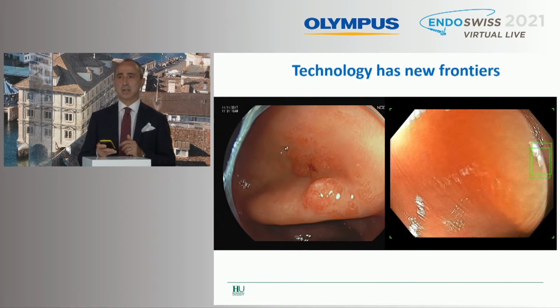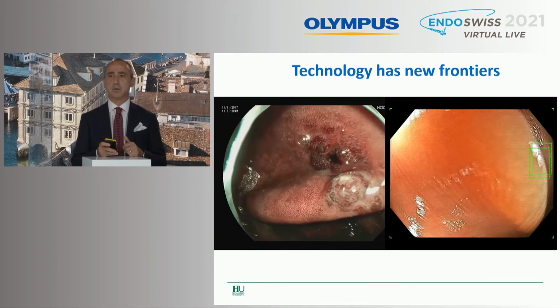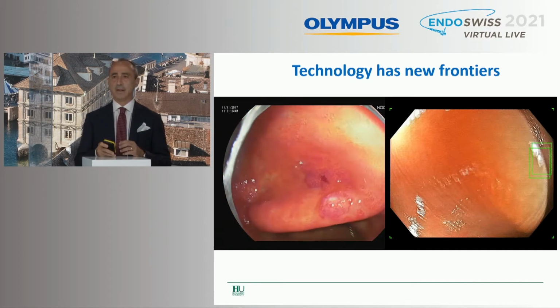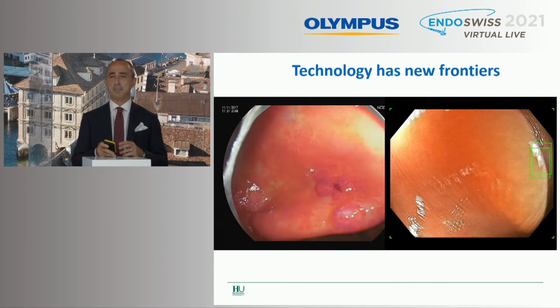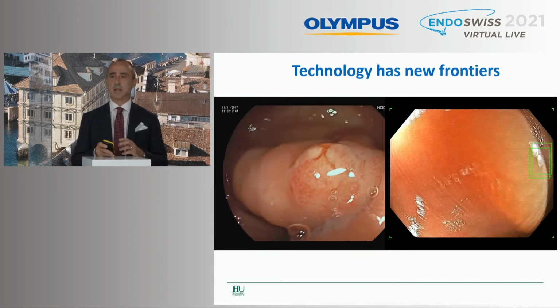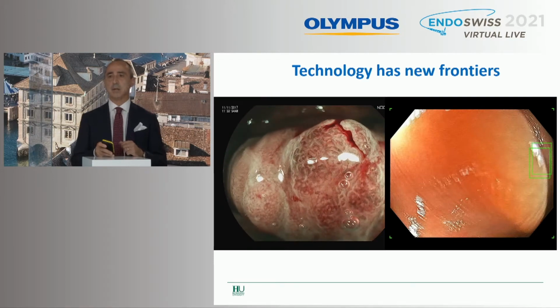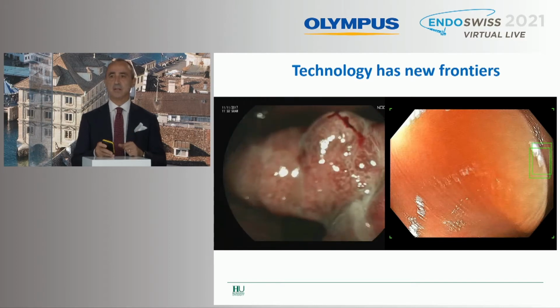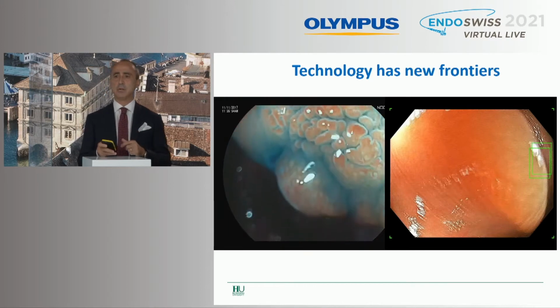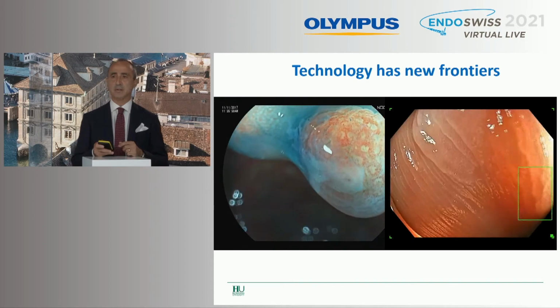So technologies as new frontiers, you can see here, if somebody can run the other video, when we are in the right colon, we have all these flat lesions that may appear a little bit strange, but when you use the latest technology, you can go into very good detail of the pit pattern, and you can understand that this is a serrated sessile adenoma with dysplastic component. Sorry, the other video is not running. It was an X1 Olympus video showing very similar findings.